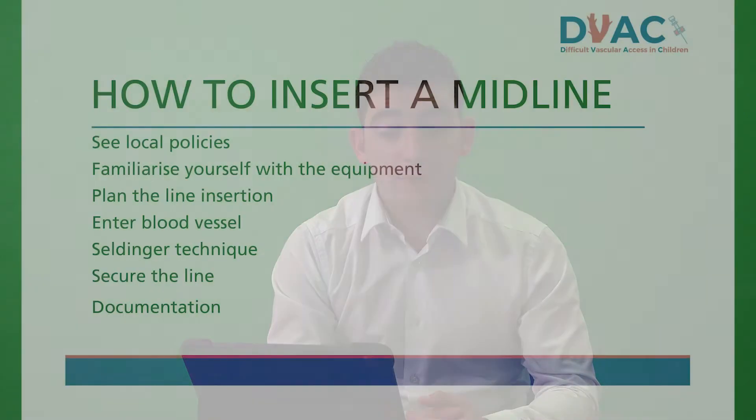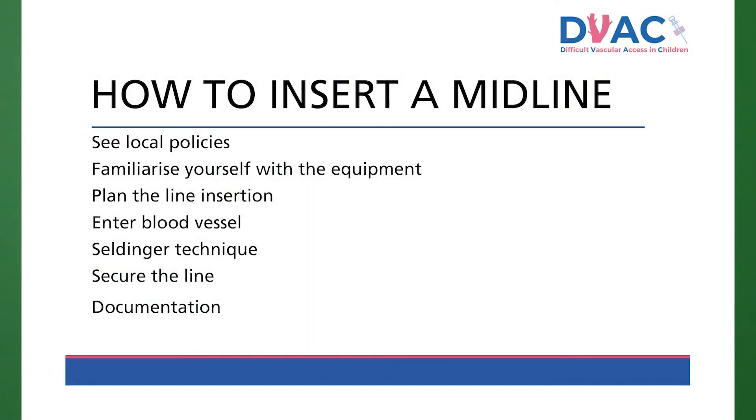Your hospital may already have guidance for insertion of lines or a vascular access team with helpful information and protocols. There will be different lines and equipment in every institute so familiarise yourself. Following parental discussion, identify a straight vein. Midlines are a bit fiddly so you often need an extra assistant to help hold the distal limb. Gather equipment and use your topical analgesia. Clean the skin and enter the vein using a cannula or venflon.